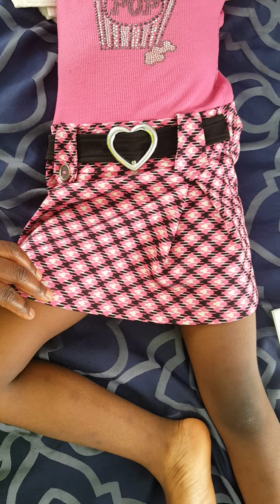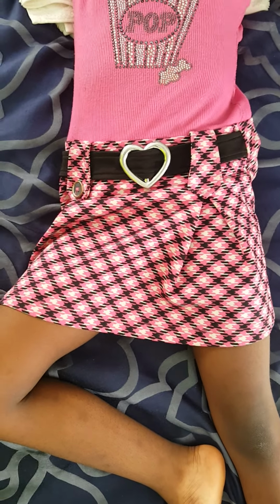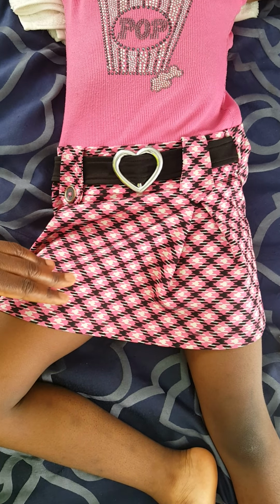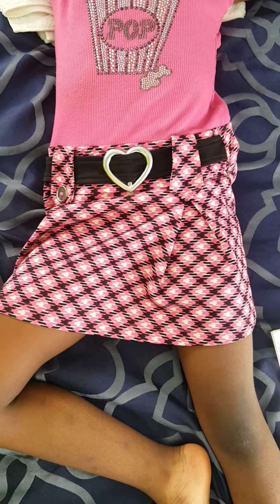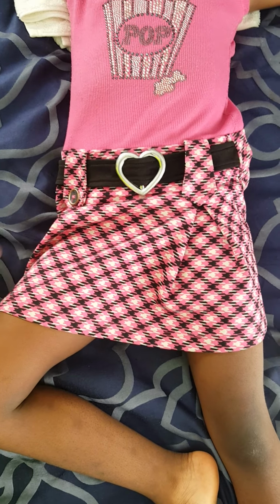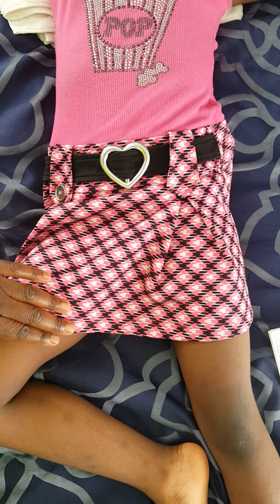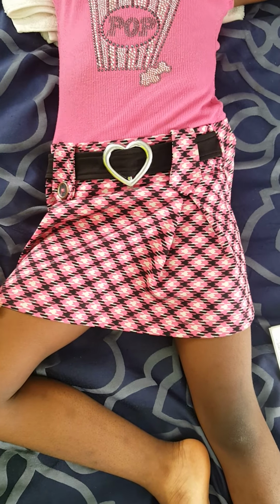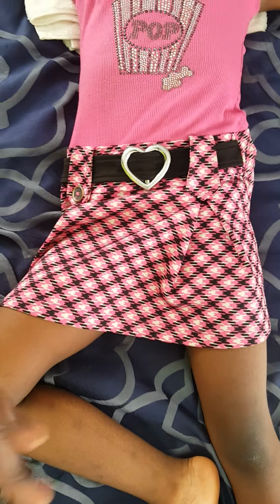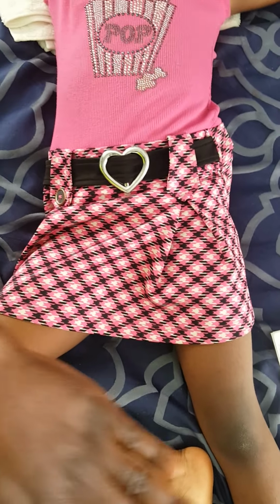For the structures shown, we will see an AP oblique projection of the femoral head, neck, and trochanteric area. The femoral head, neck, and acetabulum are completely shown. The lesser trochanter is seen on the medial side. The femoral neck is seen without superimposition of the greater trochanter. This shows that there is no rotation. If there is no rotation, this is what we will see.